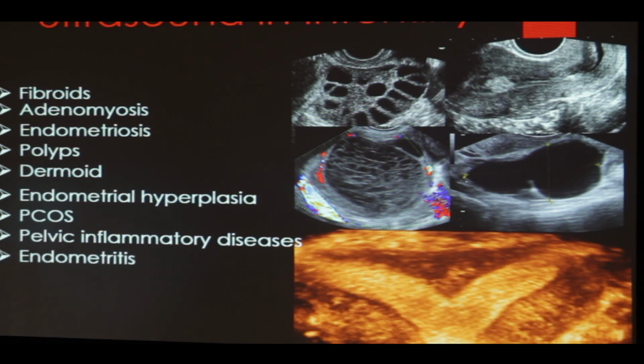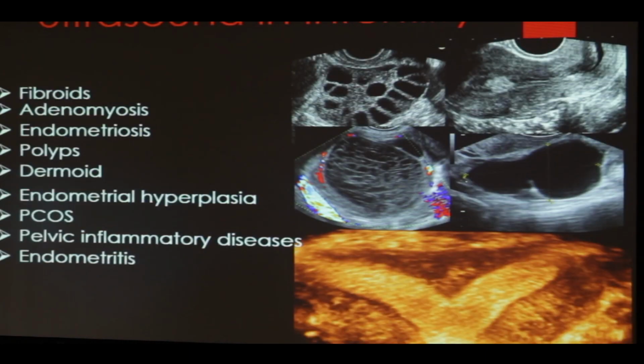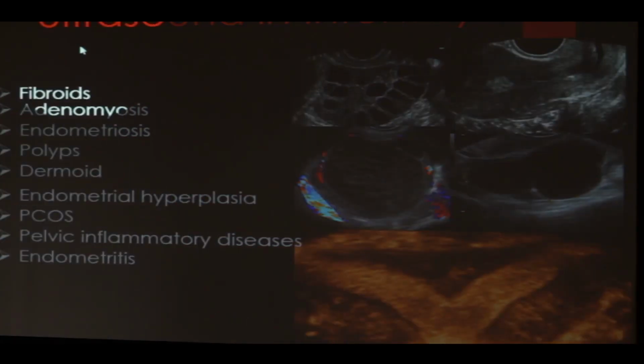So, whatever we have spoken in this female pelvis, we have to take it from A to Z, and in most cases I will pick something from this. If I know my stuff, I can do wonders with the infertility scan, but provided I will not only take the folliculometry, but before folliculometry I have to see for all these things.